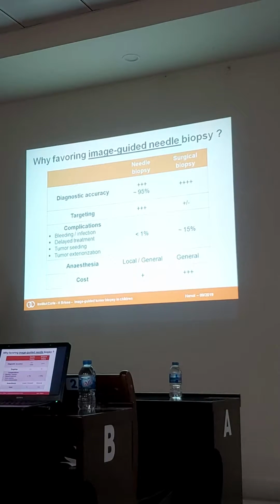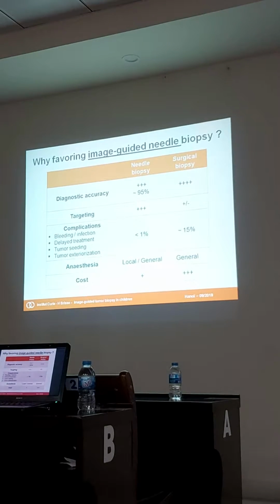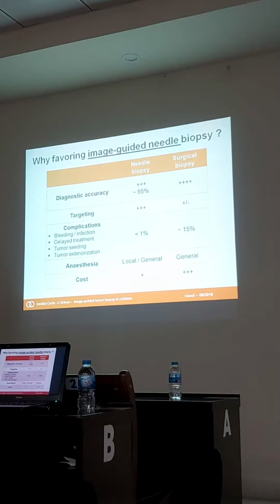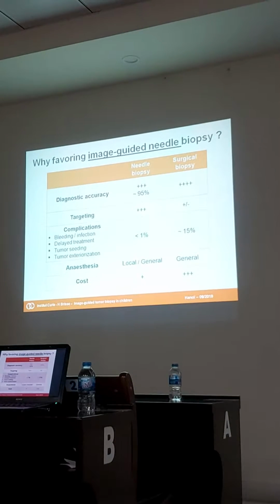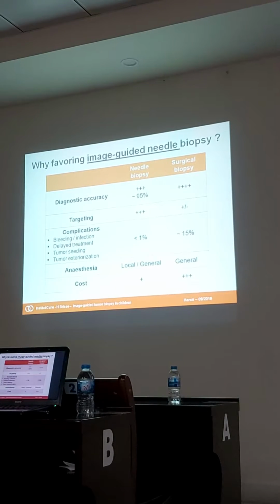When you do a diagnostic biopsy, you can always discuss between surgical biopsy or needle biopsy. I would like to convince you that the image-guided biopsy is the best option. Of course, surgical biopsy provides a large part of tissue, so it's easier for the pathologist.